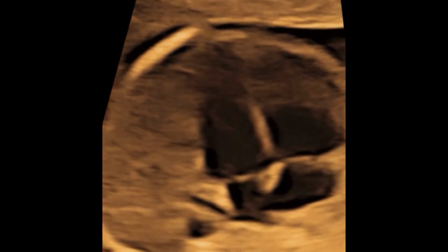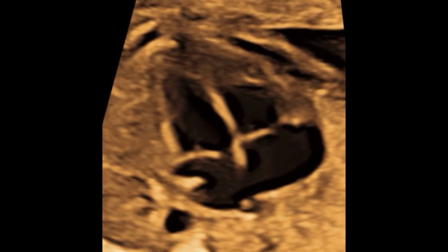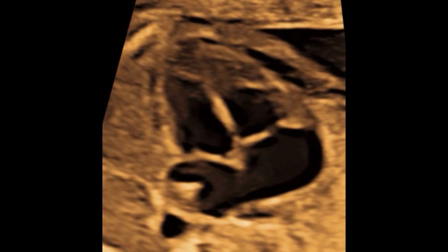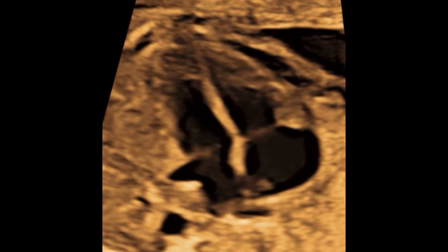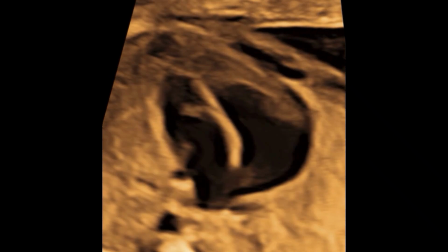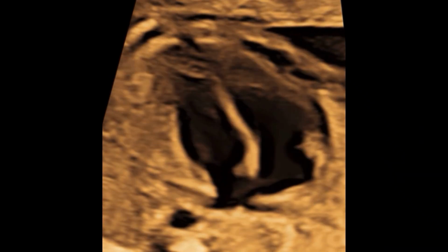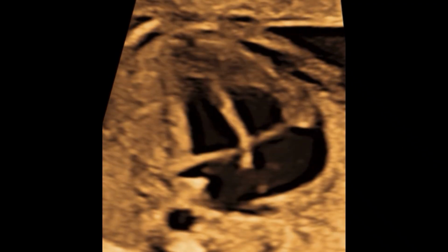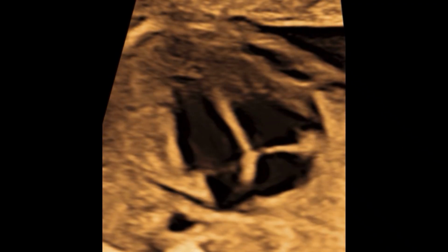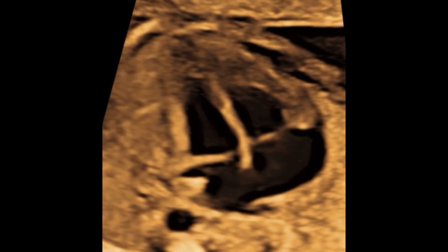Now let us see what is the time of cardiac cycle when we should measure the atria or ventricle. For that, you have to reduce the speed of the fetal heart cycle, and then you have to use the cine loop to move to and fro to find out the exact part of ventricular systole and ventricular diastole.